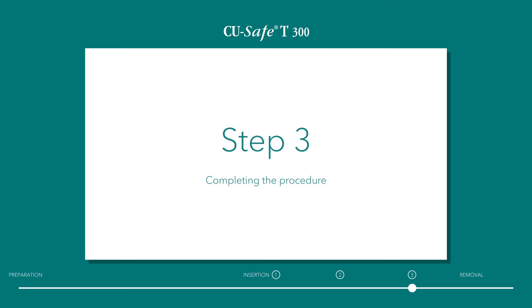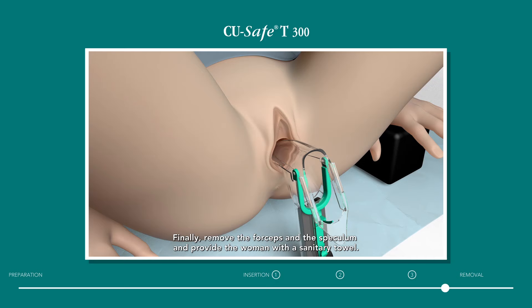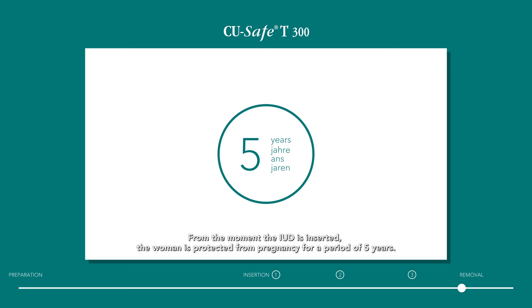Step 3: Completing the procedure. Trim the nylon threads to about 3 cm from the portio. Finally, remove the forceps and the speculum and provide the woman with a sanitary towel. From the moment the IUD is inserted, the woman is protected from pregnancy for a period of 5 years.